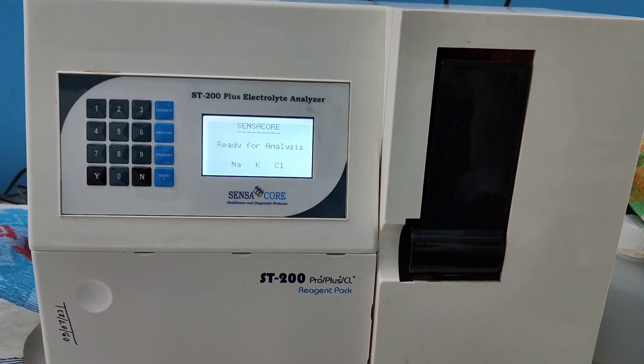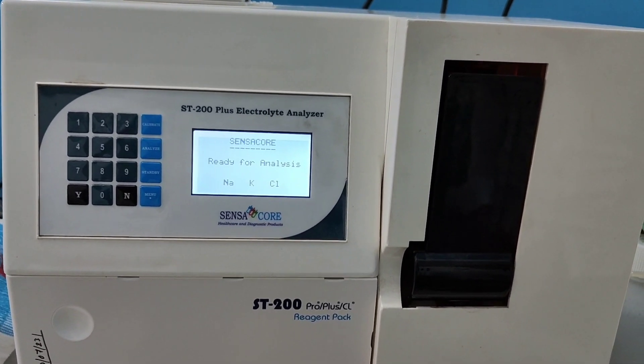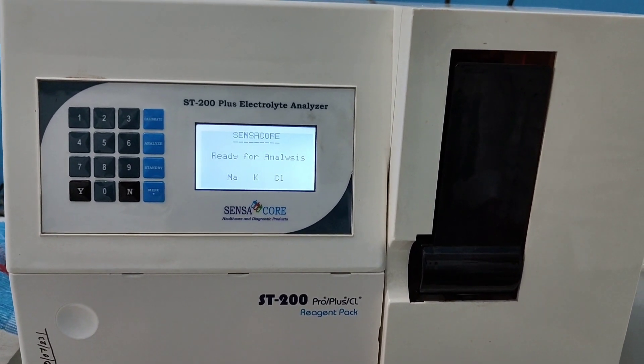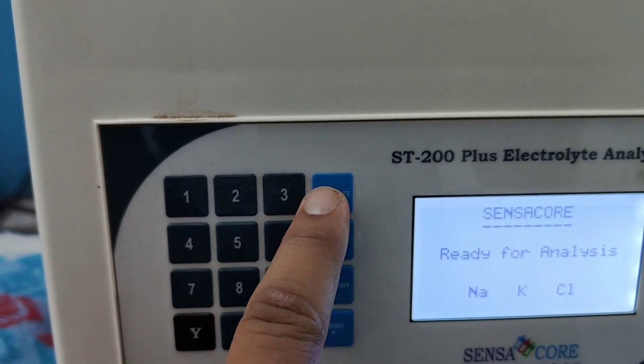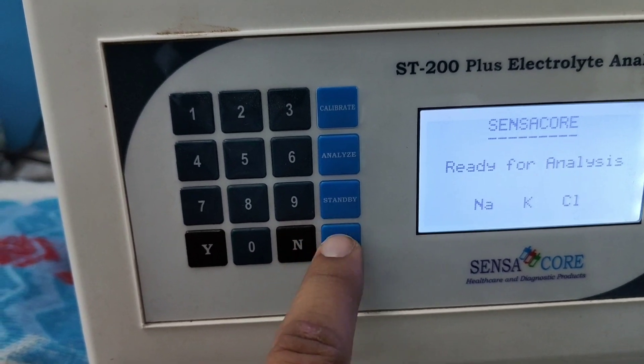In this video I am going to show you how to run a test for sodium, potassium, chloride electrolyte analysis. This is the analyze button, this is the calibration button for calibration purpose, this is standby mode, and this is the menu.